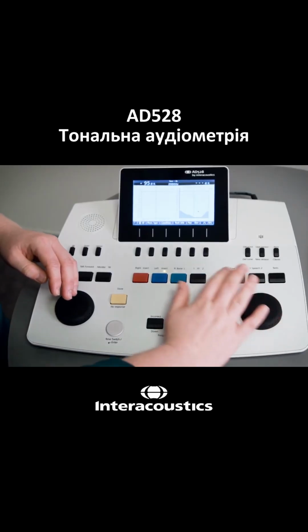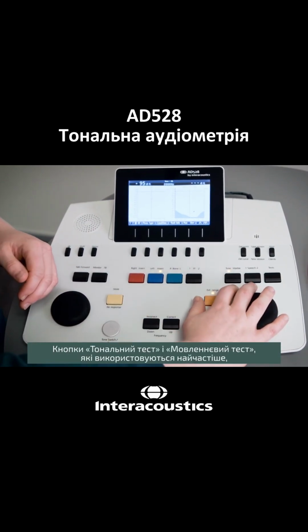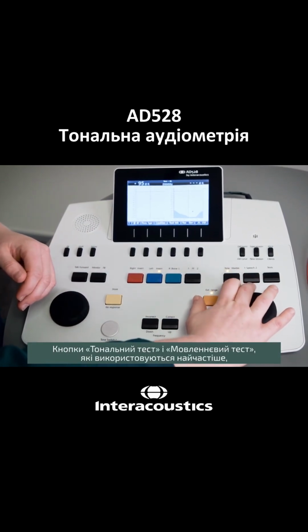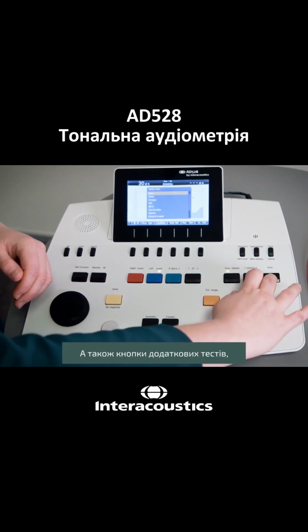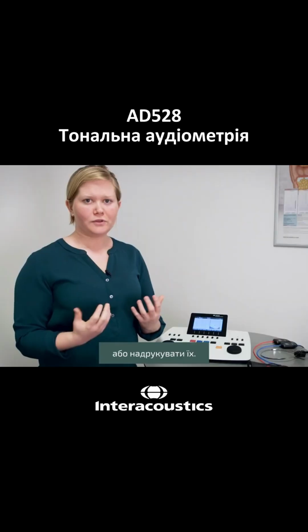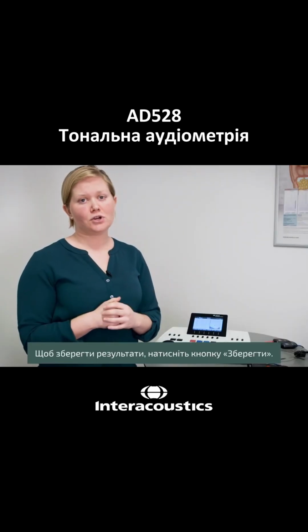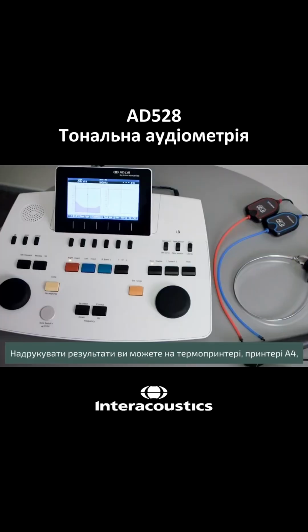Over here, just above channel 2, you have easy access to your test screens, your tone, your speech you use the most, where you can switch between the screens, and also additional tests that may be part of your test battery. You can print the results. Saving is done by pressing save, where you save to the device or to diagnostic suite, or you can print your results.